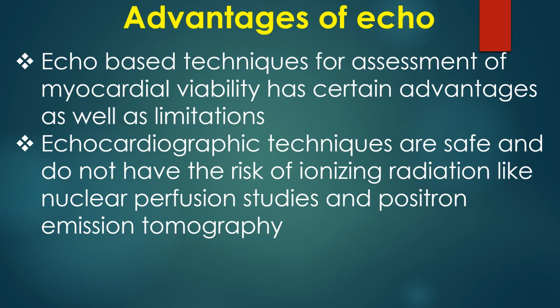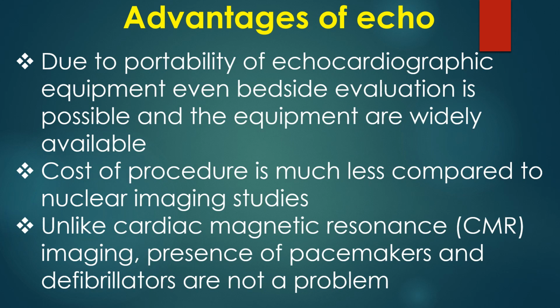Echo-based techniques for assessment of myocardial viability have certain advantages as well as limitations. Echocardiographic techniques are safe and do not have the risk of ionizing radiation like nuclear perfusion studies and positron emission tomography. Due to portability of echocardiographic equipment, even bedside evaluation is possible and the equipment is widely available. Cost of procedure is much less compared to nuclear imaging studies. Unlike cardiac magnetic resonance imaging, presence of pacemakers and defibrillators is not a problem.